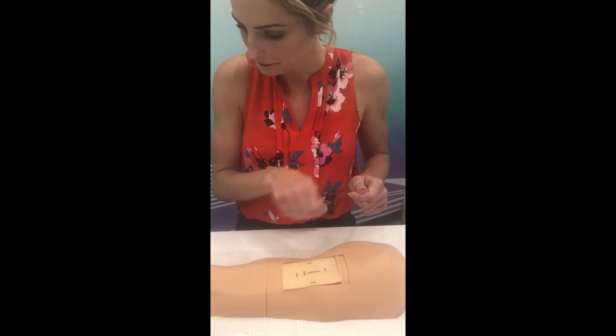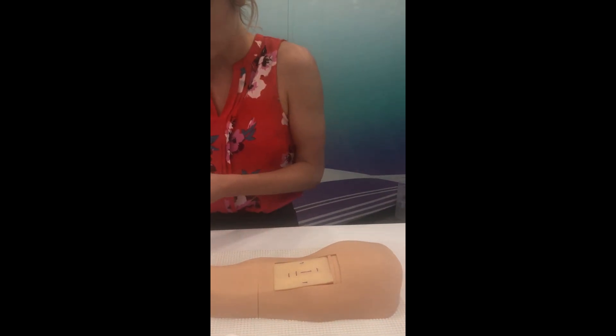Now we clean it, and now we do the lidocaine.